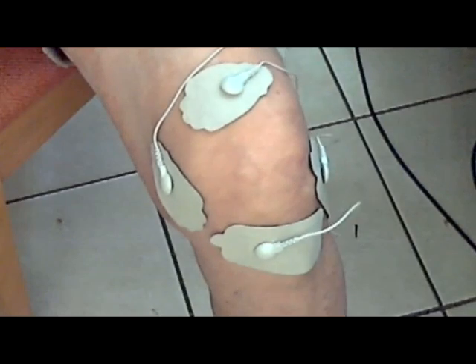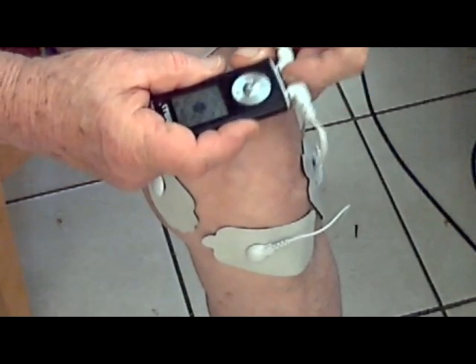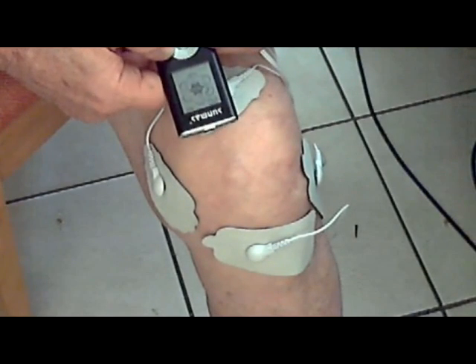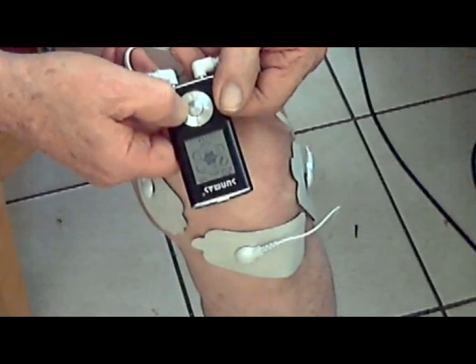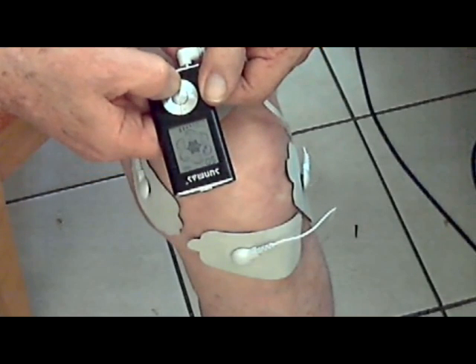You need to do this for at least an hour to achieve a long-lasting effect. Alternative treatment should be used in the burst train mode, or if your TENS unit doesn't have that, use the modulated mode. I'm assuming that you have already cleaned the area of any oils or creams that may have been applied, as these will shorten the life of your electrodes.